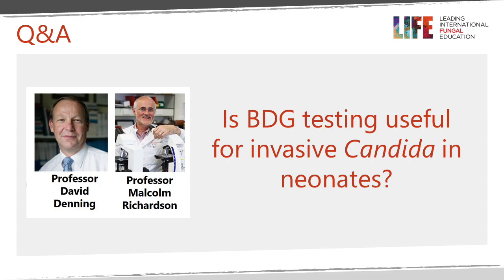Yes, there is this paper, isn't there, that came out in Medical Mycology back in 2018, looking at neonates. And really confirming what you've said, the sensitivity, specificity, not fantastic, but they set their own cutoff at 106 picograms per mil, which is higher than the cutoff that we use, for example, the Associates of Cape Cod test. But their conclusion was that the levels decreased with antifungal treatment, and the test was able to detect glucan in cerebrospinal fluid. But as with a lot of these studies, a lot of unanswered questions. And that leads us on to another question.